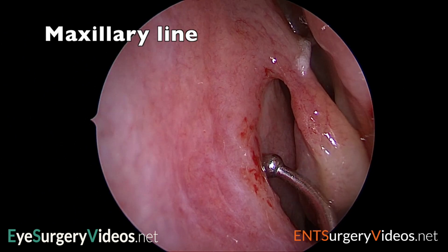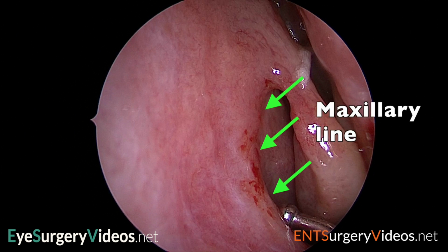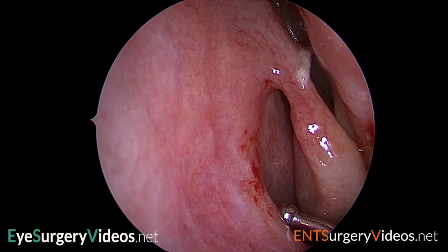The maxillary line is the medial-most projection of the frontal process of the maxilla. It runs from the axilla of the middle turbinate to the root of the inferior turbinate. It is another very important and relatively constant landmark.